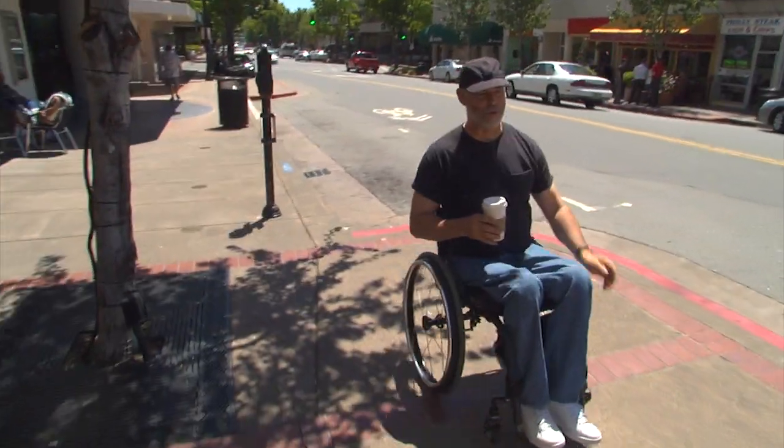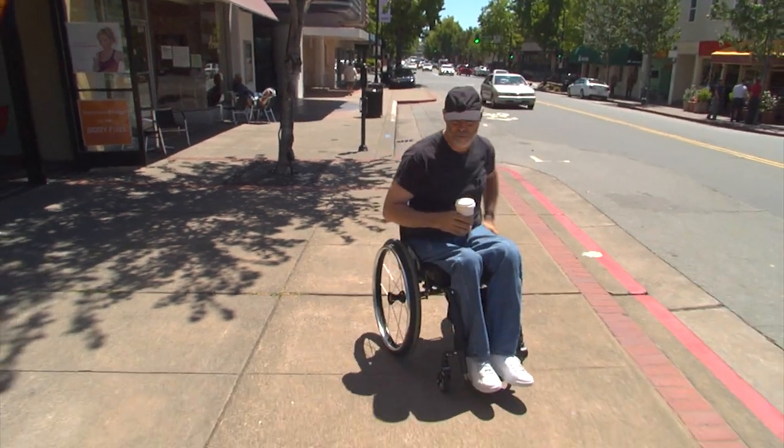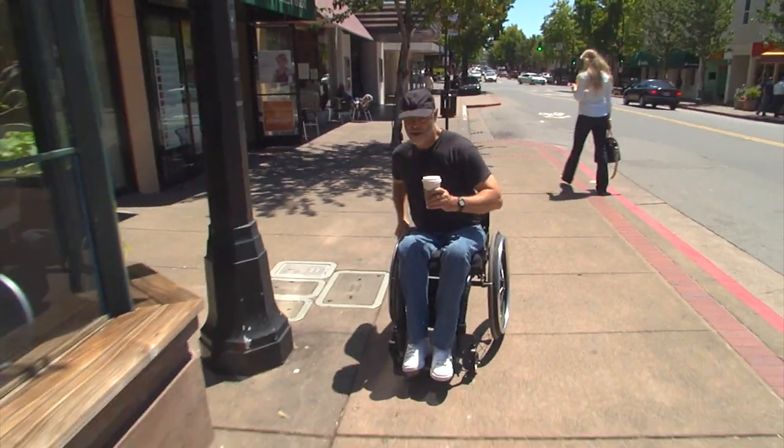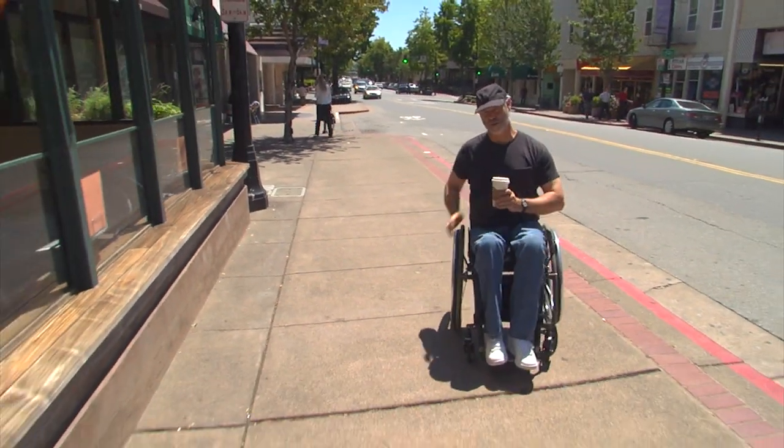And since most sidewalks slope, you can take advantage of that and choose your path so that you're wheeling with one hand a little more often and don't have to switch hands quite as much.